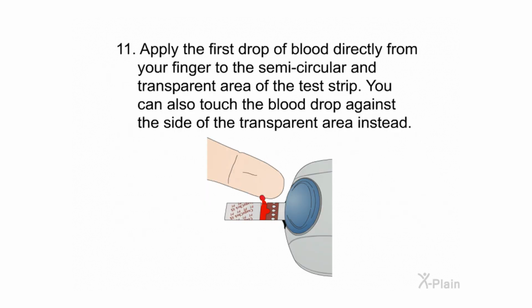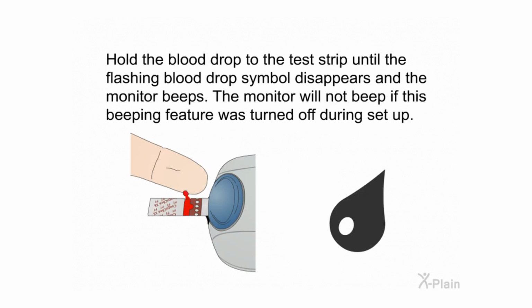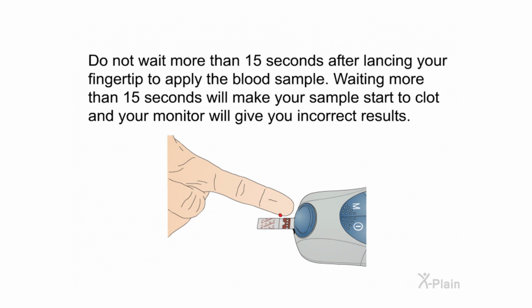11. Apply the first drop of blood directly from your finger to the semicircular and transparent area of the test strip. You can also touch the blood drop against the side of the transparent area instead. Hold the blood drop to the test strip until the flashing blood drop symbol disappears and the monitor beeps. The monitor will not beep if this beeping feature was turned off during setup. Do not wait more than 15 seconds after lancing your fingertip to apply the blood sample. Waiting more than 15 seconds will make your sample start to clot and your monitor will give you incorrect results.